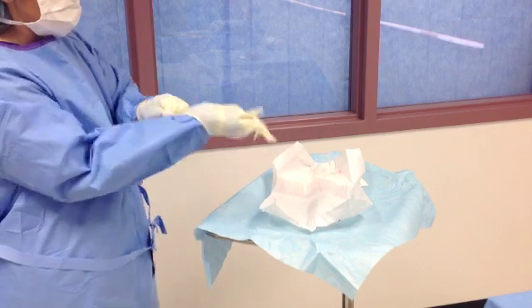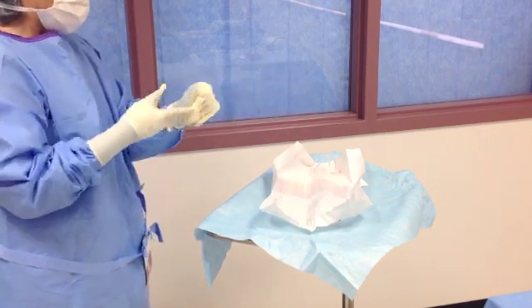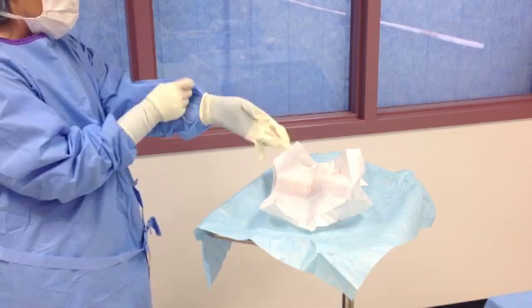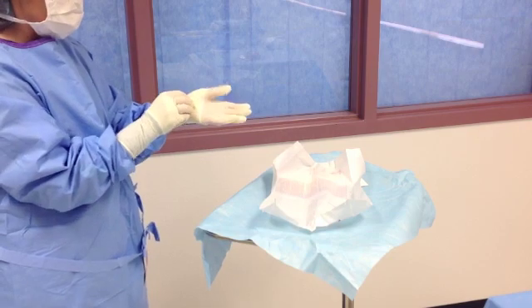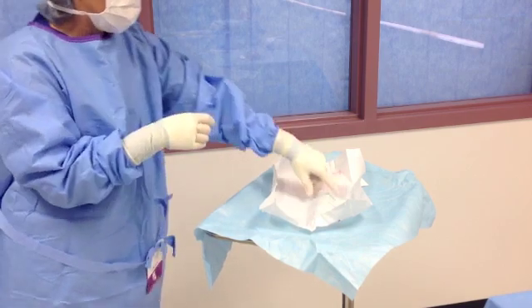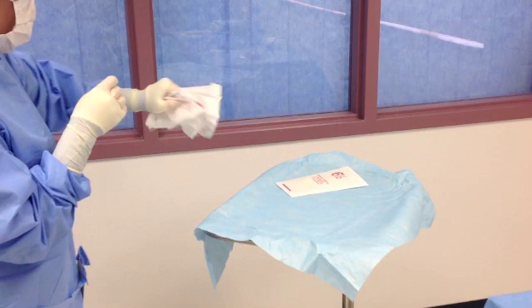Once you have both gloves on, pull back on the blue sleeves to remove any wrinkles or folds. Don't pull too far — you have to keep the white cuff underneath the glove. Discard the glove package by grasping the center of the inside of the package and wad it into a more manageable size, being careful not to touch the edges of the package.